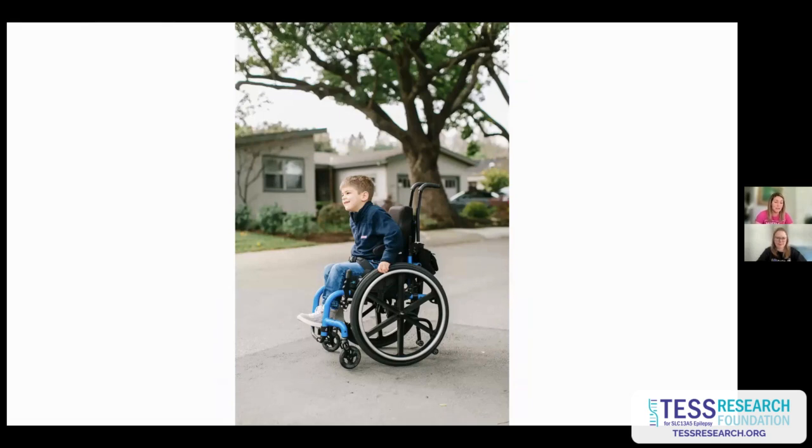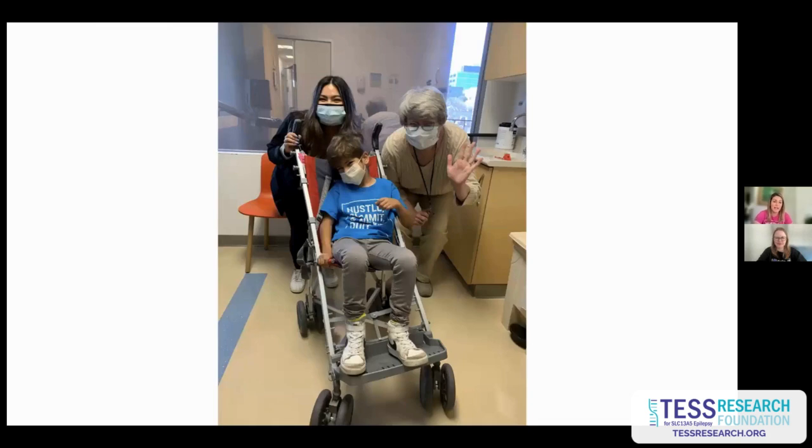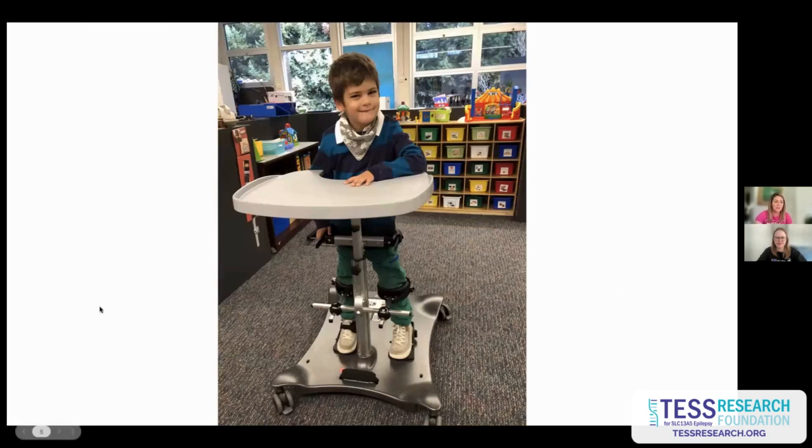At this point, he doesn't use a wheelchair. He remains very unsteady on his feet, but he really likes his independence. But for longer distances or when he's tired, we do have an adaptive stroller. And this has been a really great fit for our family. It goes on airplanes with us and all that good stuff so that we can do all the activities that we want to do as a family. At school, he does use a stander, and that can just help make sure that he's getting that input in his feet and hips. I'm not a physical therapist, so I won't pretend to know all the good things that it's doing, but it has been a useful piece of equipment for him.